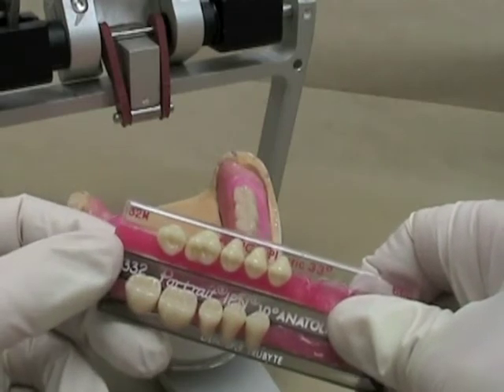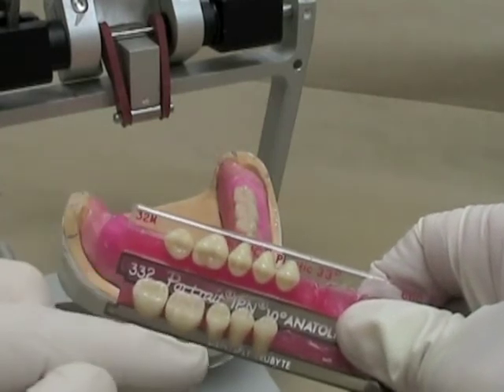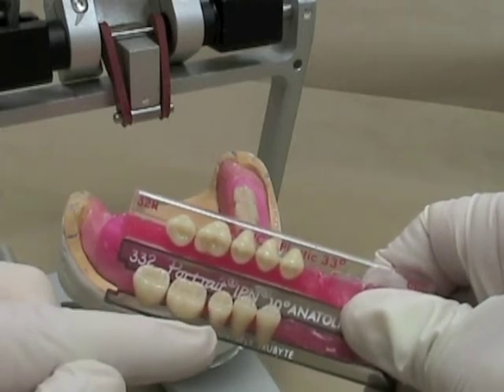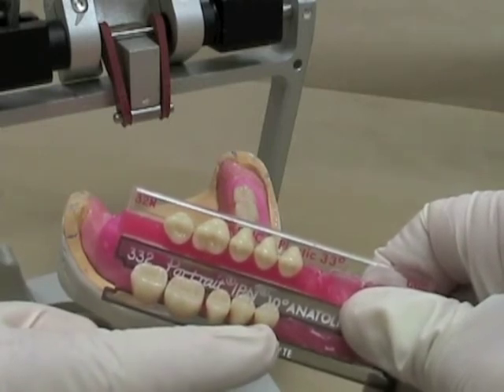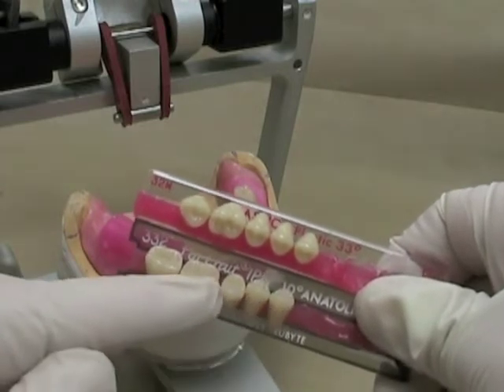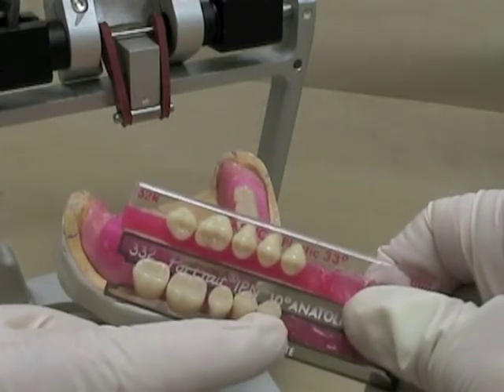For our lingualized occlusion, we're using a 33-degree upper against a zero-degree posterior, or in this case a 10-degree anatoline tooth. If you've got steep condylar inclinations, you usually want to use something with a little bit of cusp height, like an anatoline.